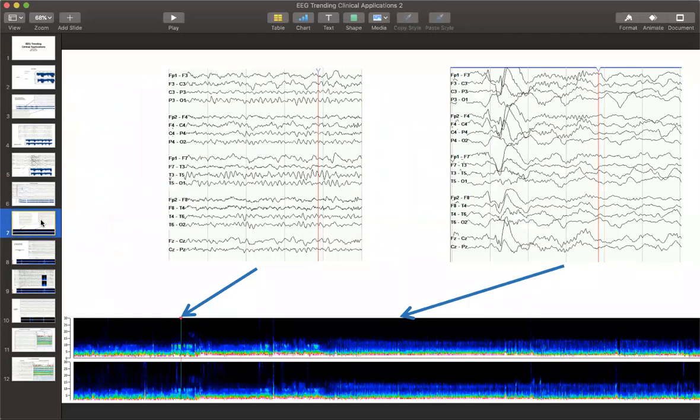So outside the NICU, we tend to use other types of quantitative EEG, like the CSA or the CDSA, the compressed spectral array, or the color density spectral array. I was reading that in studies, it takes the average EEG reader, if they're reviewing a 6-hour study at a speed of 5 pages per second, 20 minutes to read 6 hours of EEG. And that's if you don't do anything else, if you don't pause to look at things. So a 24-hour EEG can be quite time consuming.